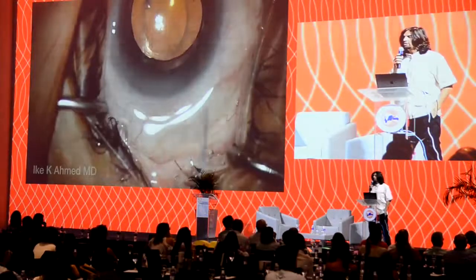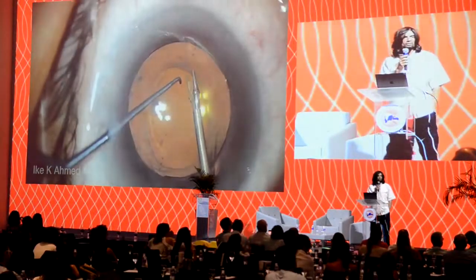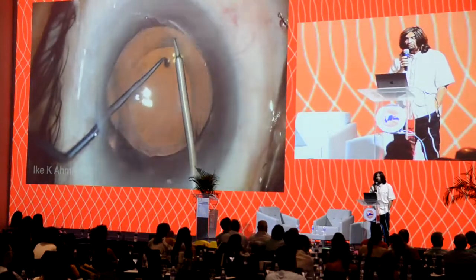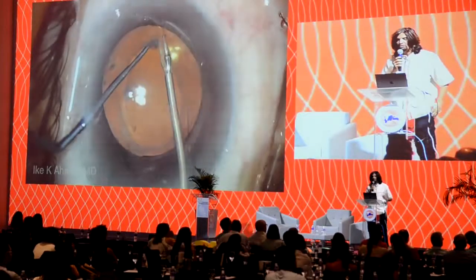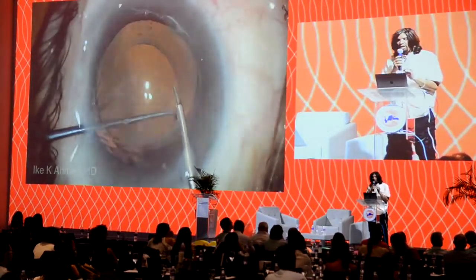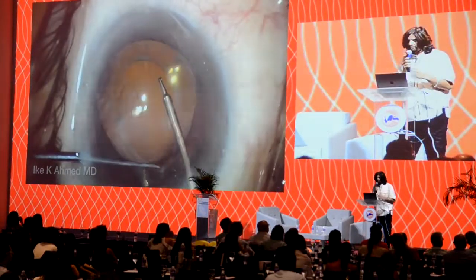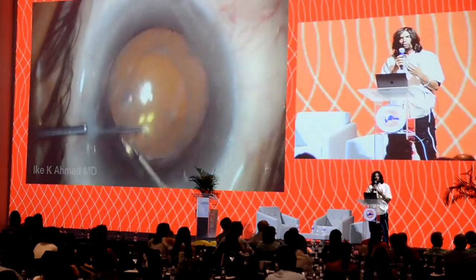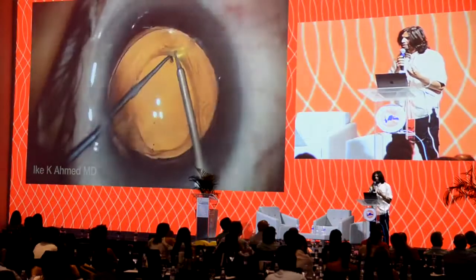And if we proceed within the first month or so, we typically can do this without having to open up the capsular bag very much. Of course, why do lenses rotate? There's many reasons. One reason is because of retained viscoelastic. Here I've injected viscoelastic in the anterior chamber, but not into the capsular bag. The reason is because there's still a lot of room there. The fibrosis is still not wrapped around the haptics typically.